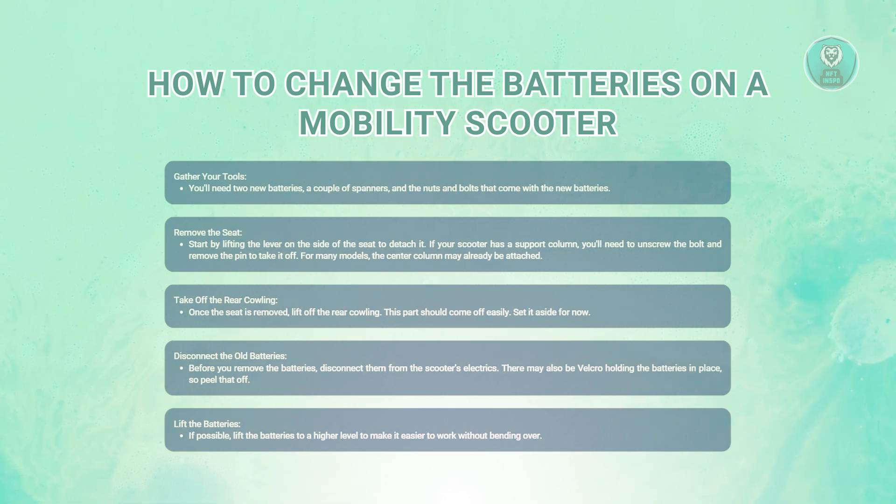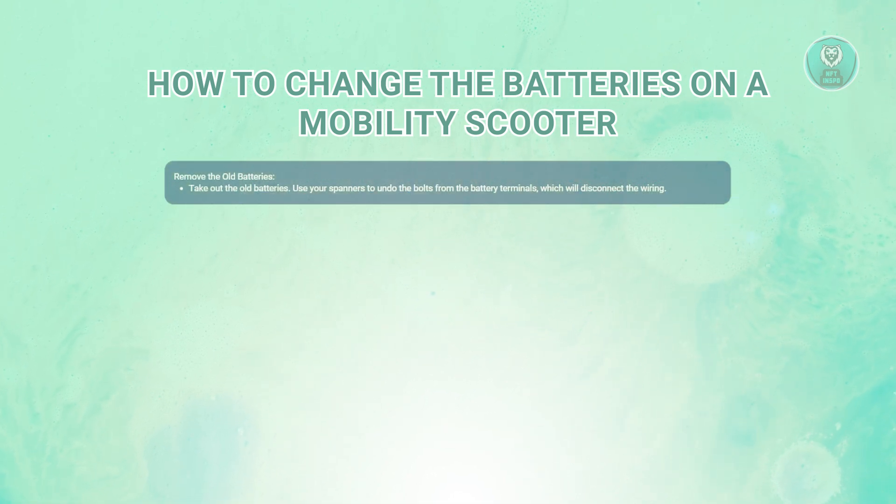It's also a good idea to lift the old batteries to a comfortable height if possible — this will make it easier to handle the next steps without straining your back. Go ahead and take out the old batteries. Use your spanners to undo the bolts from the battery terminals and disconnect the wiring. Keep track of which terminal is which: red for positive and black for negative, to avoid confusion later.